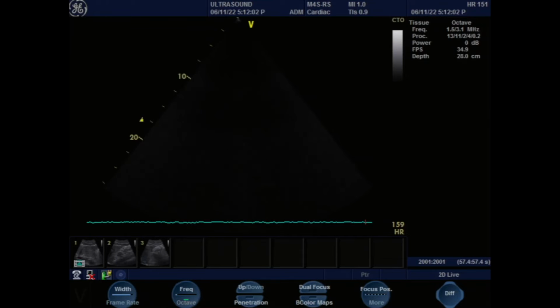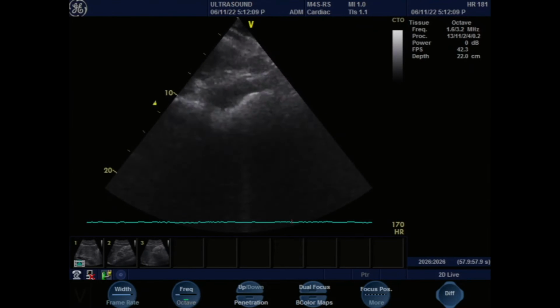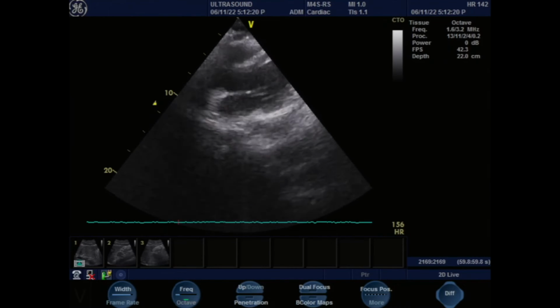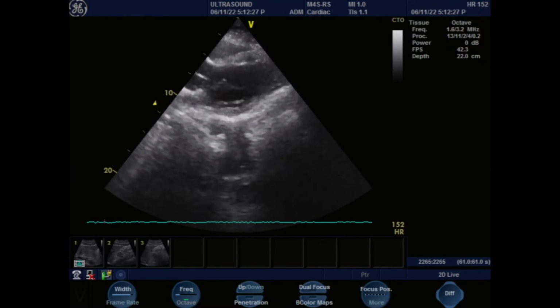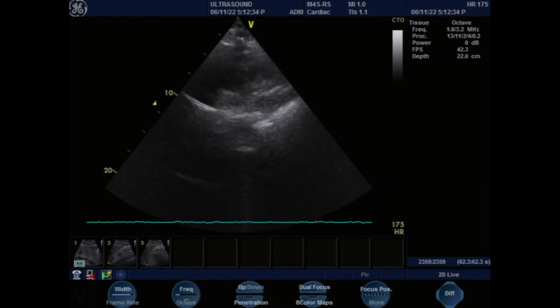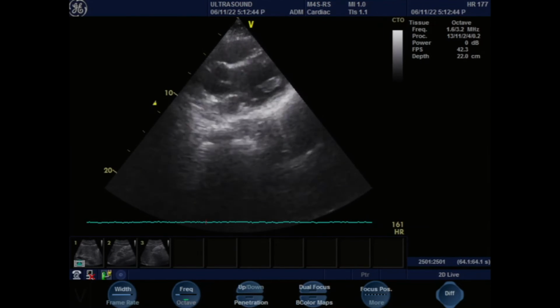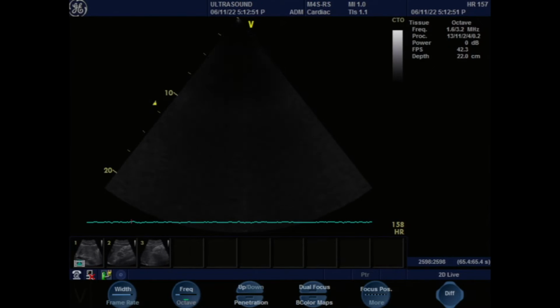So you want to get parasternal views. This is the view that we saw earlier. Now the depth of the view, you can already see it. This is a short axis view, yeah, exactly. If you just go up a little bit, you can go up to the second intercostal space. The heart is different in everybody in terms of how high it lies, so you can go up and down. What you're looking at is the view that we saw earlier with the aorta. This is the parasternal long axis view. I think your probe is on upside down. This light should be on the other side, so this way.